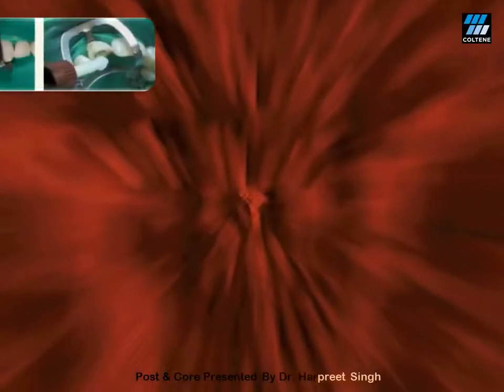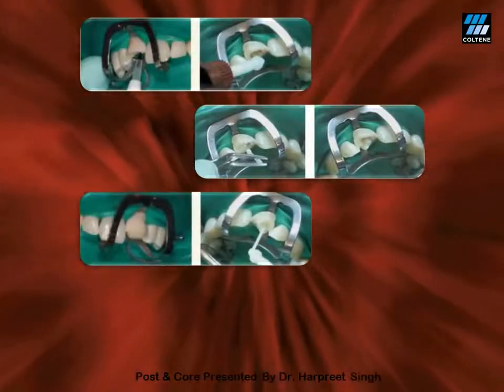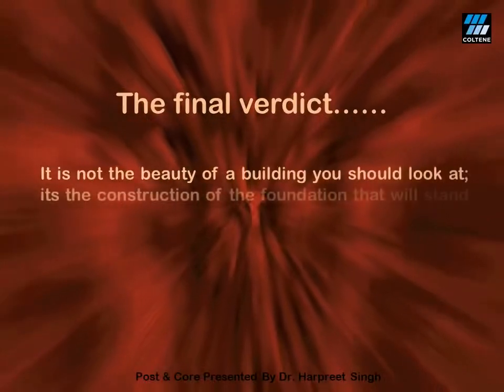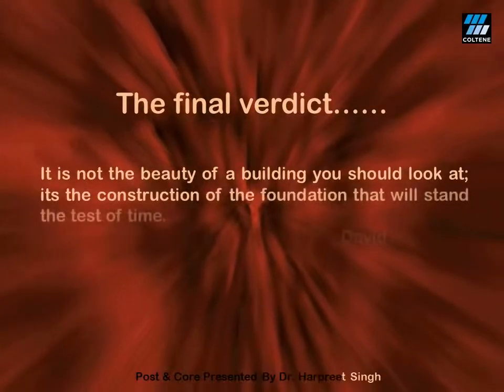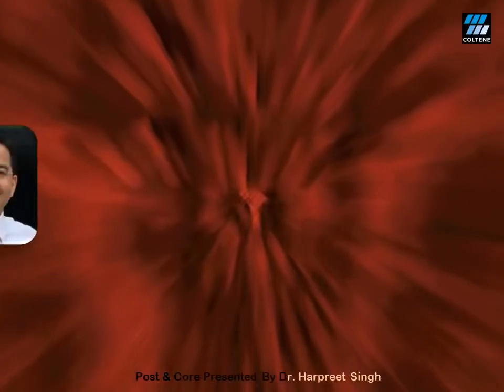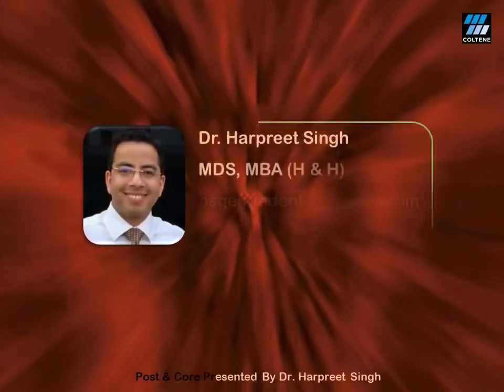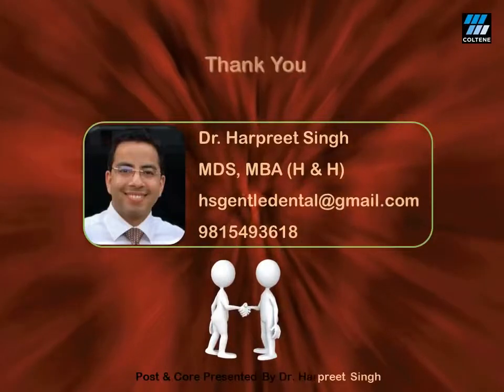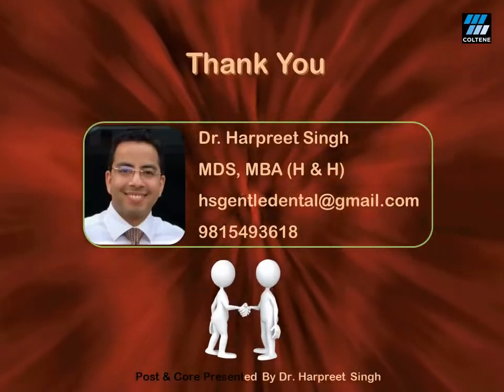Here is another case of a maxillary central incisor where the step-by-step procedure of luting the post followed by a core buildup has been demonstrated. Ladies and gentlemen, the final verdict: it is not the beauty of a building that you should look at — it is the construction of the foundation that will stand the test of time, as said by David Allen Cope. I am leaving here my details of mobile number and email ID for you to contact in case of any query. Thank you very much for your valuable time and patience. Stay blessed.